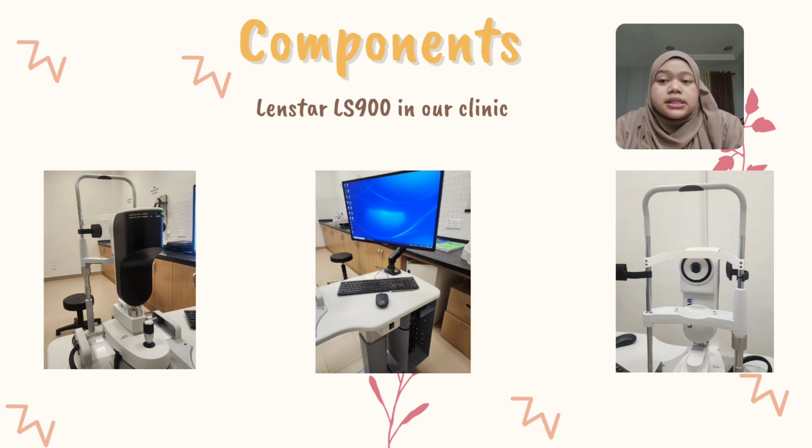The images in the slide show the Lenstar instrument that we have in our clinic. The Lenstar components have two parts, which are the Lenstar itself for the examination and the other one is the PC. The examination part is connected to the PC via a USB connection. The Lenstar 900 is operated using the iSuite software installed on the PC.